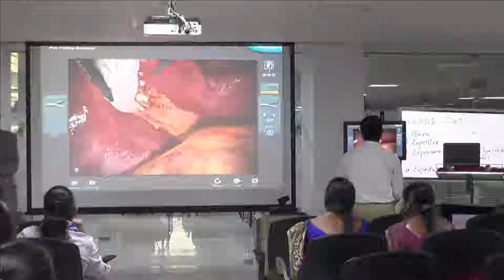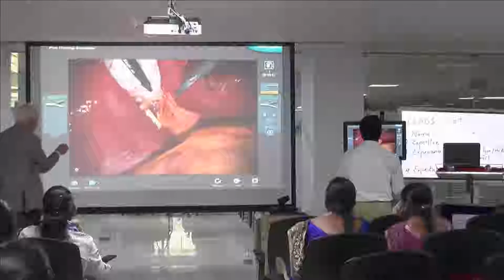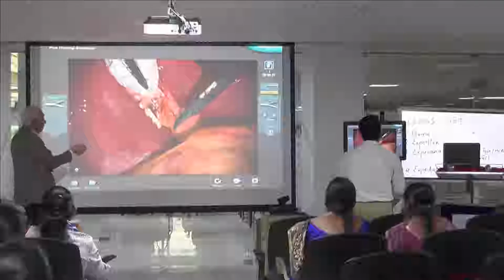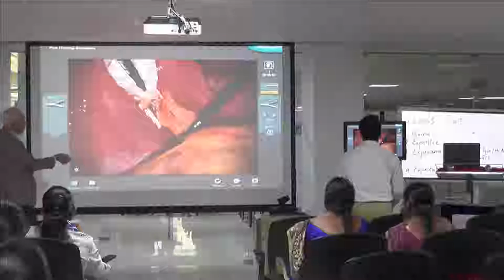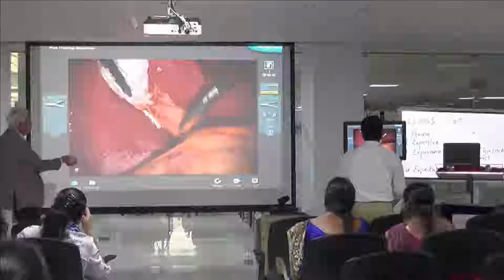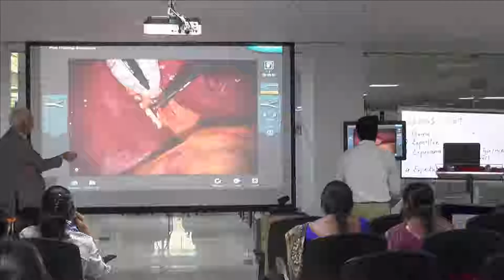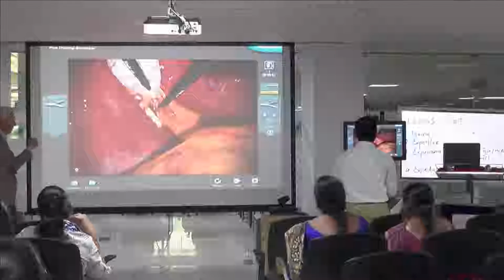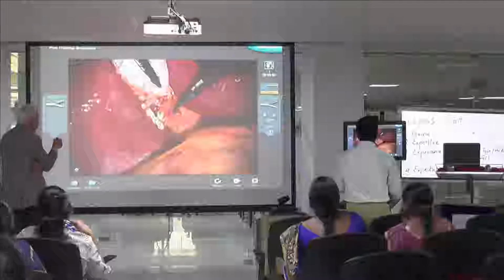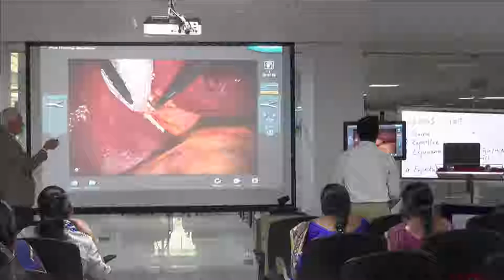So it means that you have a length of a cystic duct in view and the length of an artery in view of about 2 centimeters, that means that it will allow you to put enough clips. So don't go there because it's dangerous. Here is hepatic duct. You have to avoid it. Still, you need to remove a bit of this tissue because the clip will not work well if there is too much tissue inside of the clip. So still we need to do a bit of dissection.